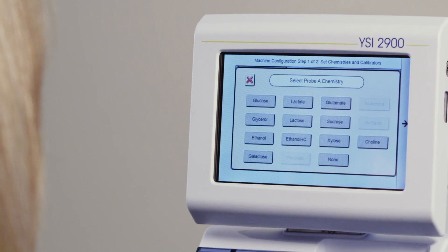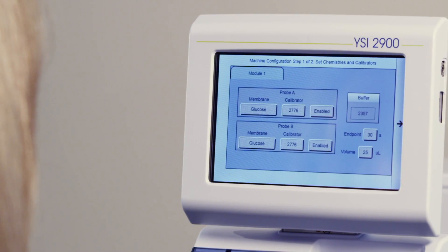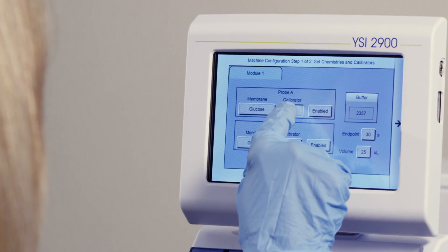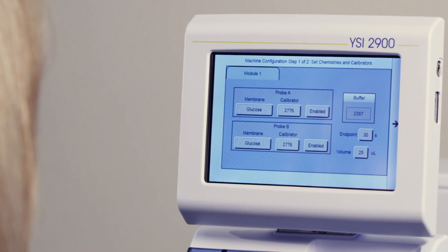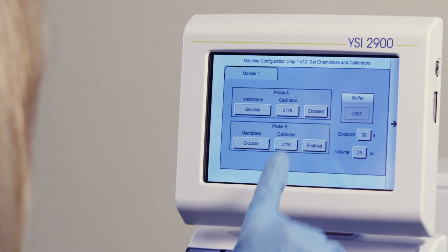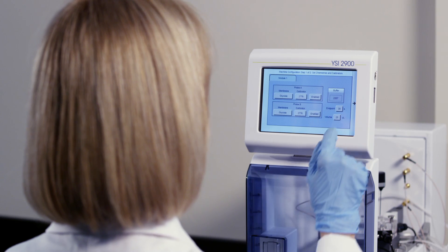Under Probe A, press the button under Membrane. Press what you're going to measure. We're measuring glucose. Press the button under the word Calibrator, and select the product number for the calibrator you are using. Make sure that the probe is enabled. Leave the endpoint and volume as shown.